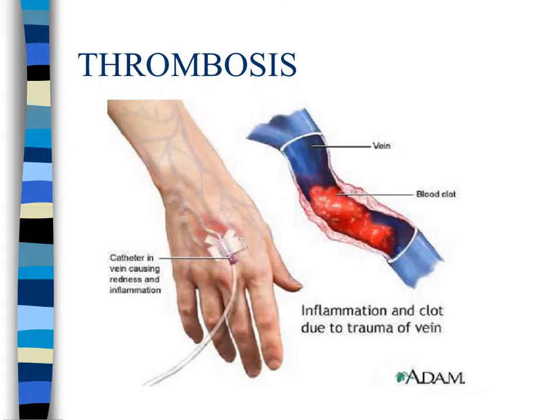Documentation includes documenting the change of the infusion rate, steps taken to solve the problem, and the end result. Be sure to chart the new IV site, its patency, and the size of the catheter used to restart the infusion. Also document the appearance of the previous occluded site.